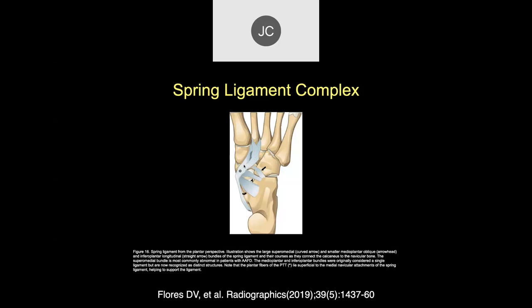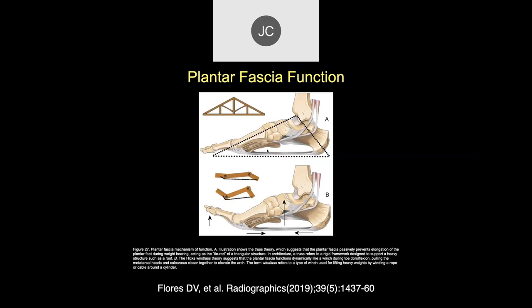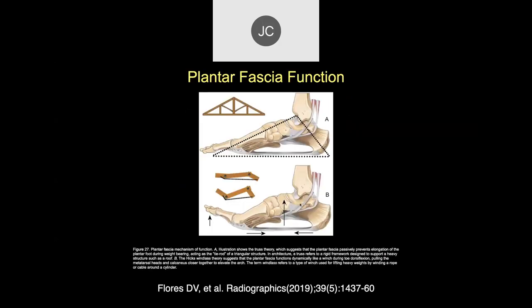The deltoid ligament has a deep component going between the medial malleolus and the medial margin of the talus, and then the superficial components. Looking at the arch like the roof structure, you have a nice normal arch here, and the plantar fascia stabilizes the base of this plantar arch. You also have the other tendons, which are important. And this is a longitudinal component of the spring ligament down there.